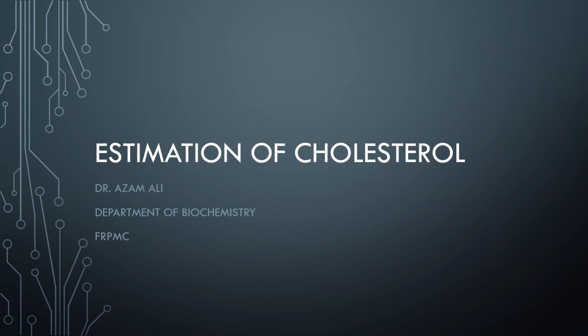This video is a part of online practical series for the cardiovascular module. Today's topic is estimation of cholesterol. This video is divided into three parts. In the first part, we'll briefly discuss structure, function, and biomedical importance of cholesterol. In the second part, the principle, procedure, and calculation for the estimation of cholesterol will be explained. And in the third part, the estimation of cholesterol will be practically demonstrated to you.